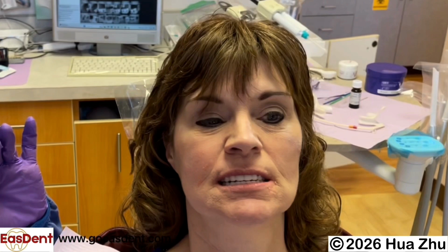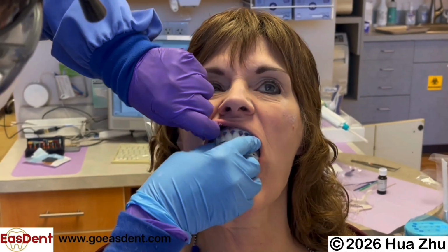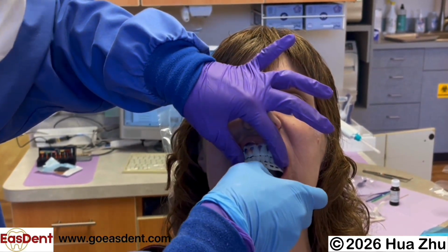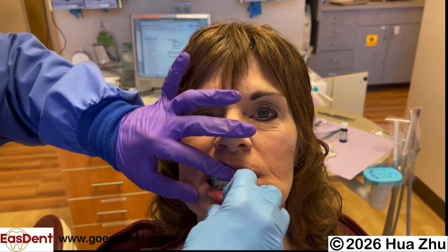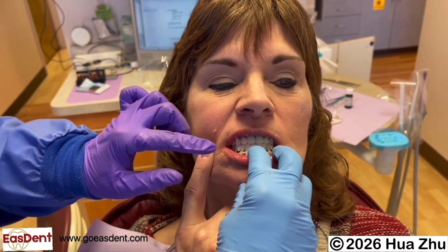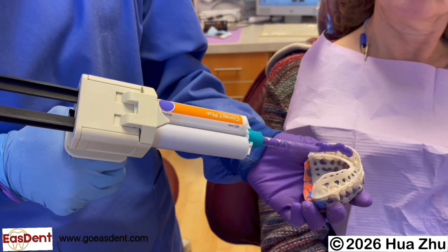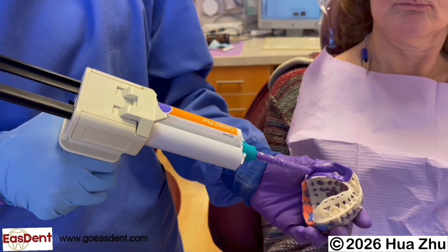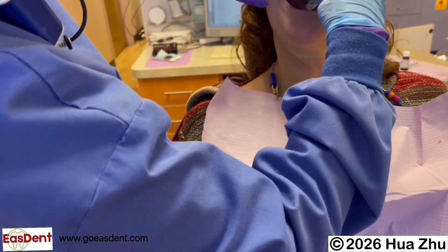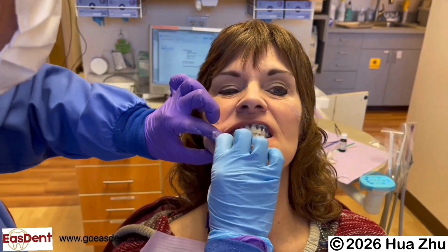If maxillary Easdent teeth are in a good position, you just need to adjust the mandibular tray. When both the maxillary Easdent impression and the mandibular Easdent tray are in the mouth and their teeth are articulated correctly, and the patient is biting down at centric relation to the preset starting VDO, ask the patient if anywhere is hurting or if anything is pushing too hard in the mouth. You can quickly identify the location of the high pressure area by loading super fast bite registration material in the area, seating the trays back in the mouth, and letting the patient bite again.